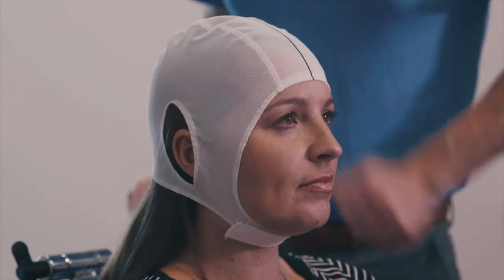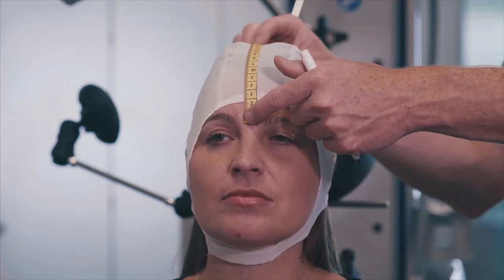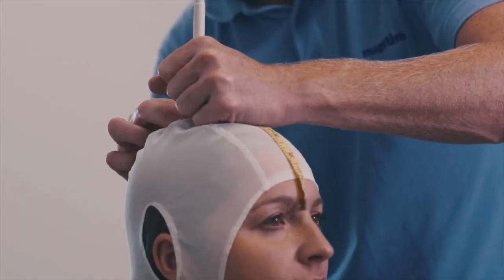For repeatable positioning, measure the gap between the nasion and the cap and make a note of this measurement. Measure from the nasion to the inion across the midline marker of the cap and make a mark at the halfway measurement. Mark this as CZ.